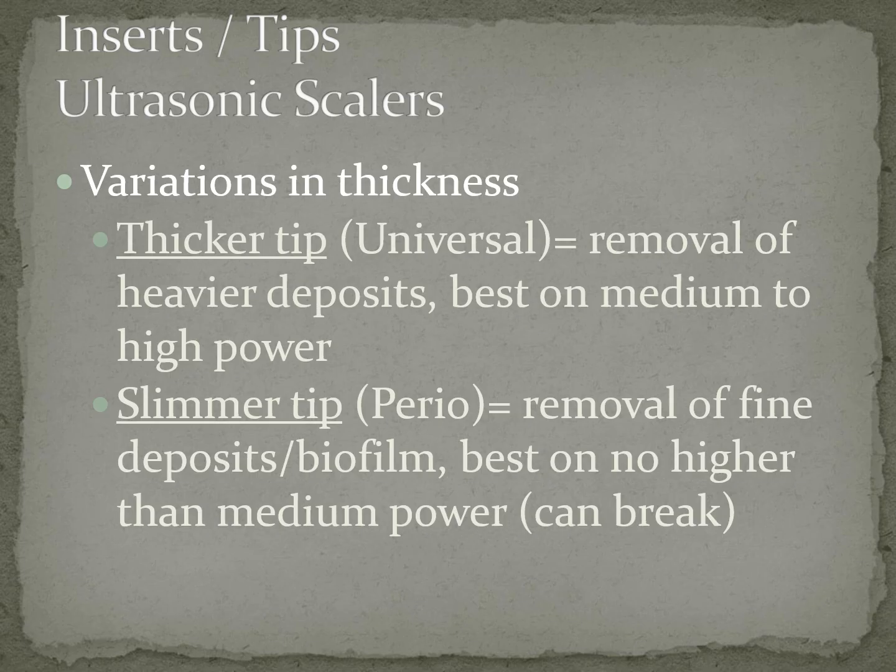Our slim tip, this is going to be our perio tip. So this is going to get down deeper into the pockets. And we're going to use it more for the removal of fine deposits and to disrupt that biofilm. It's going to be best on no higher than medium power. Okay, if you turn this up past medium power, there is a chance that that tip can break, and I've seen it happen. So make sure that you're paying attention to your power and which tip that you are using.